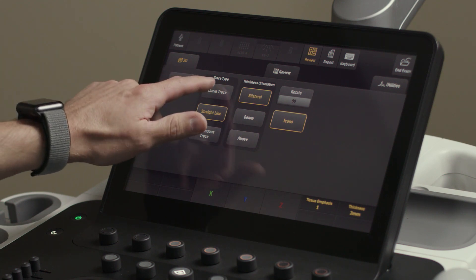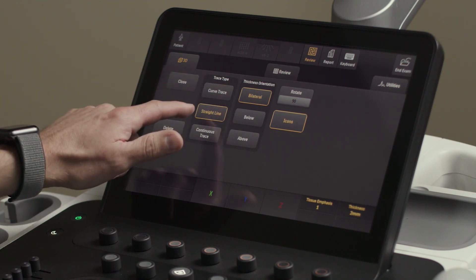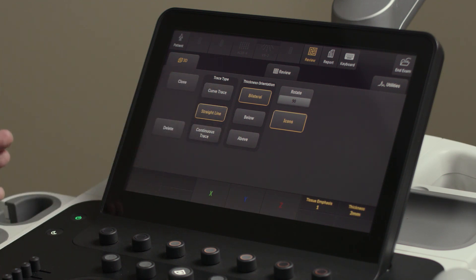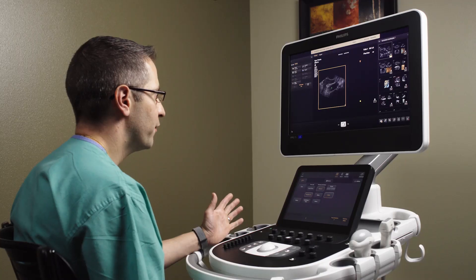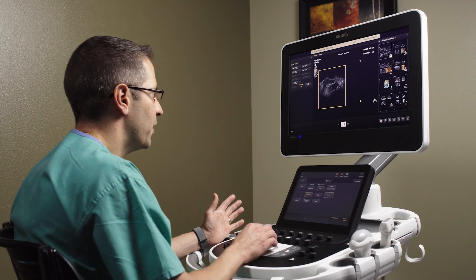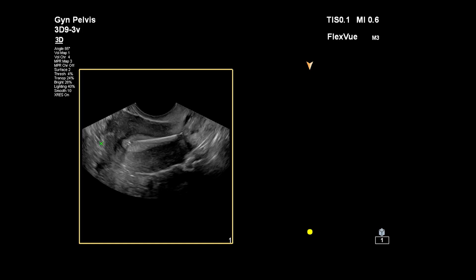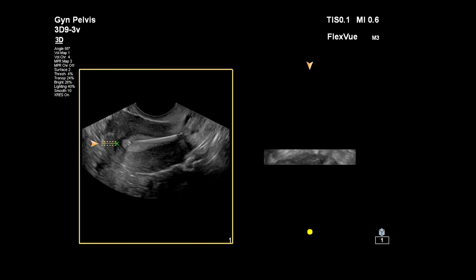The trace type options are curve trace, straight line, or continuous trace. We're going to use straight line for this portion of the demonstration. We're going to move from the fundus and deploy this straight line.